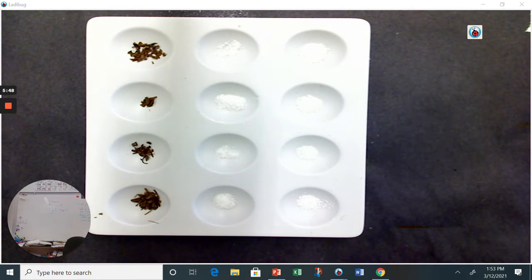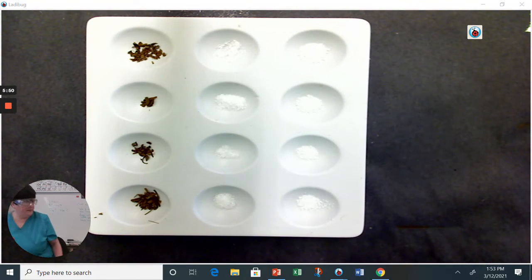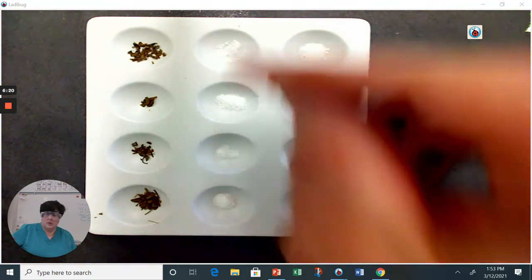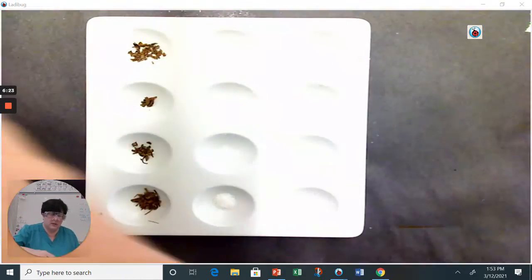Okay. I'm going to leave our appearance row. So we're going to go through and do the next set. There's 3 more reagents that we have to add into it to test with. And where did they go? So I'm going to add HCl. Across. Where did my HCl go? I just set it out. Here it is.